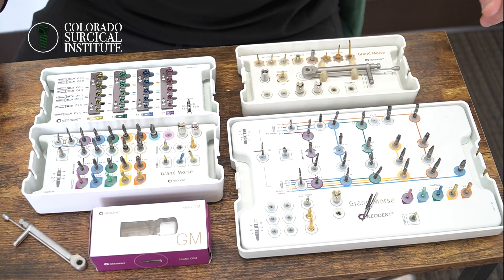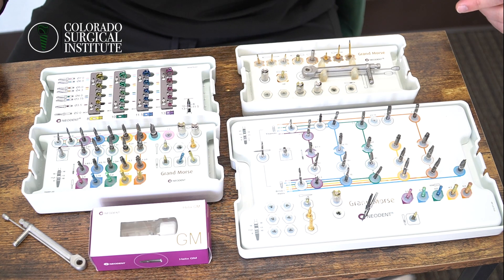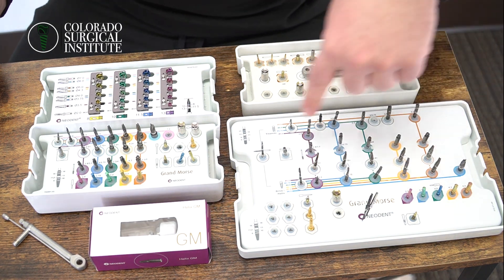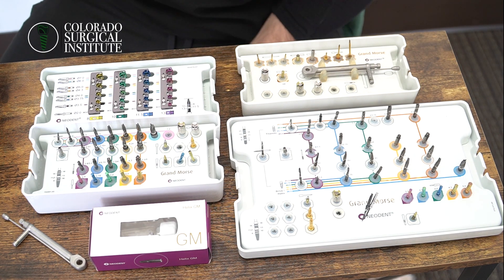Hey everyone, let's go over all of the Neodent instrumentation here and a couple of extra burrs that I've added into the mix. This big kit here is the GM's full surgical kit. On the other side right here, this is Neodent's compact surgical kit.